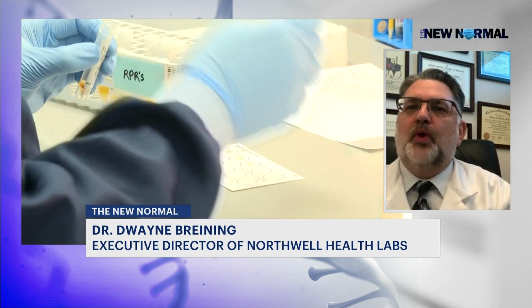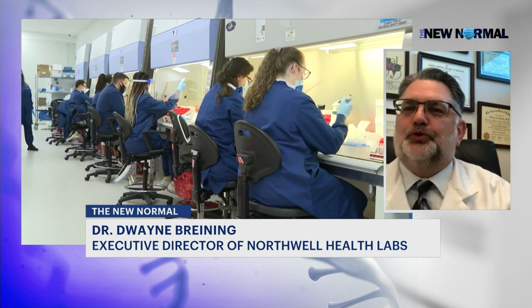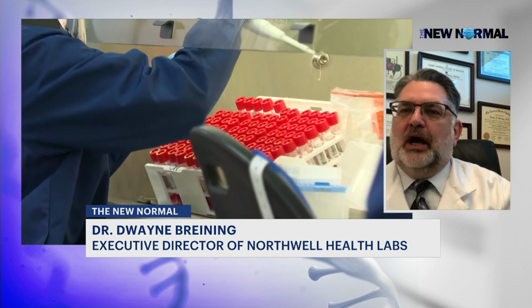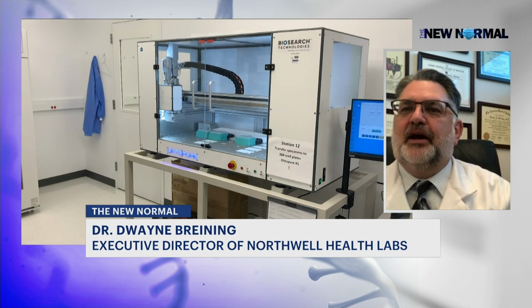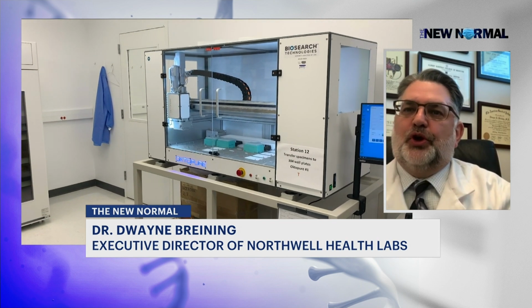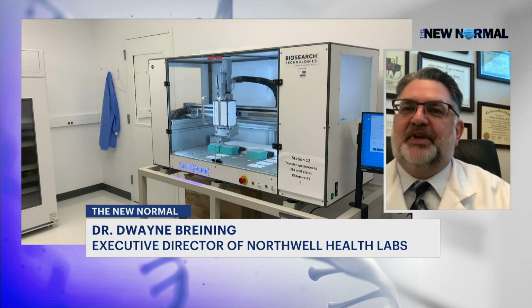So if it takes you a week or two to get results of sequencing back, you need to make a choice about treatment before that. So one of the reasons we like this new system is we could set it up to detect a mutation that was present on Omicron but not present on Delta. So we'd be able to do it as rapidly as any PCR test.